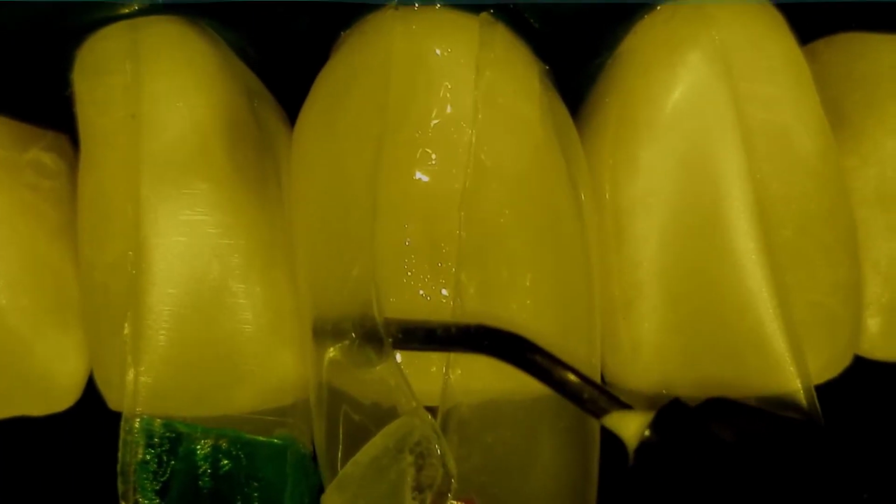And so we gently prepare the tooth by removing all of the biofilm so we get good adhesion to the tooth. And then we wrap the tooth with these special forms, and then we inject this white composite material. And it's an incredible material produced by 3M. These composites are used now to build jet airplanes. So the material can be very, very strong when it's injection molded.